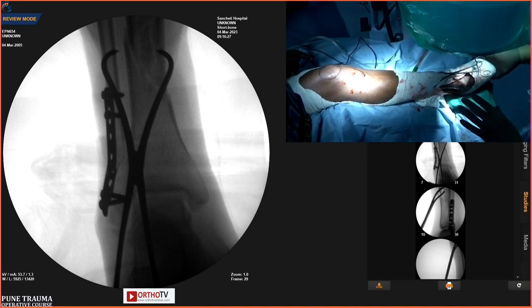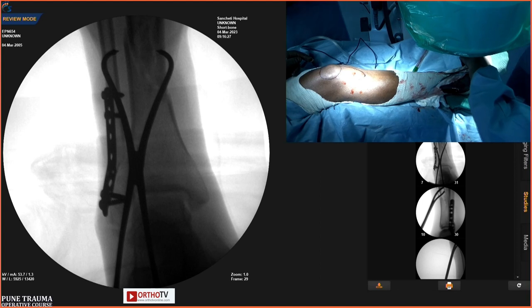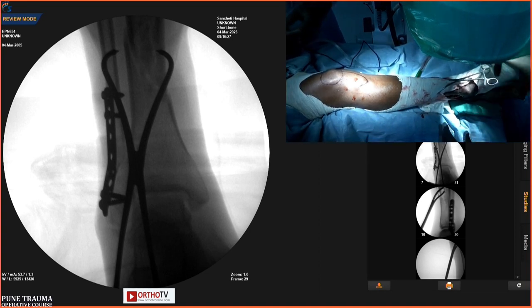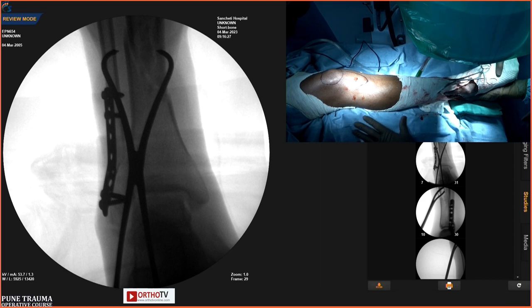Now what I will do, my assistant will hold the foot and the calcaneum in the desired position, and he will not change it. I can pass a Steinmann pin through the calcaneum also so that it may not come in the way. Now this is 20 degrees flexion. It is more than 20 degrees because Chetan wanted to do it by an infrapatellar approach. So we'll change slightly again and make it straight.